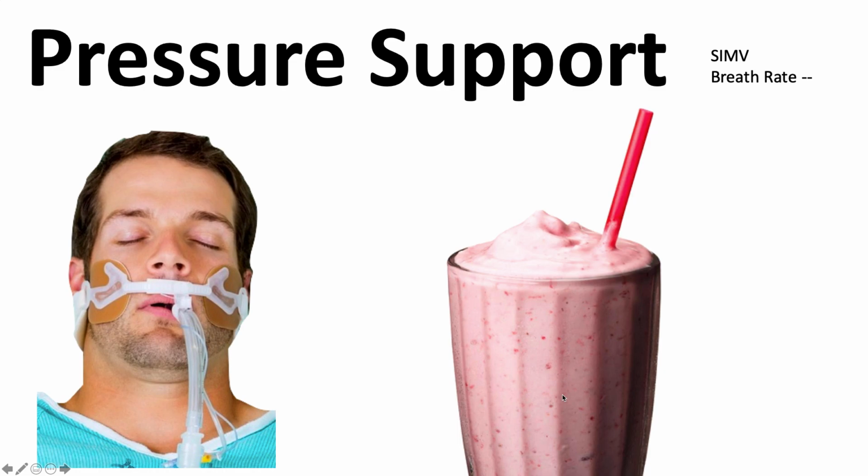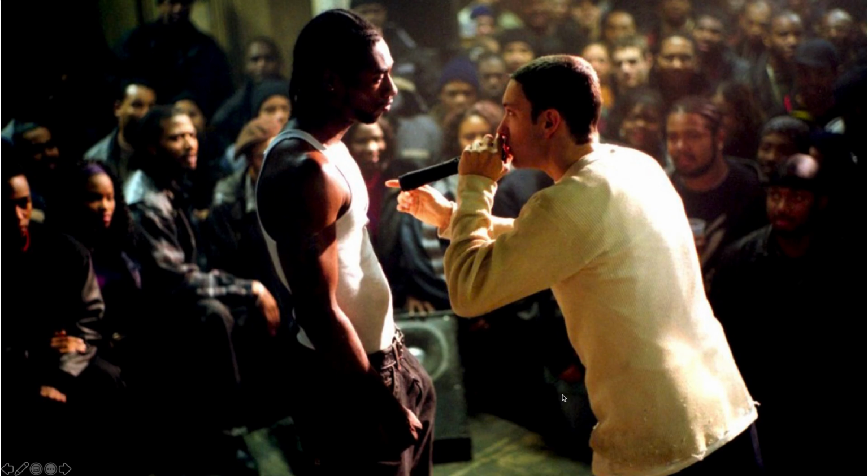That's pressure support. So think of freestyle rap battles. Again, the patient's doing everything themselves. The singer's doing everything himself. We might have a little support from a microphone and an amplifier, but otherwise he's doing all the work himself. The pressure support just eases that work a little bit.